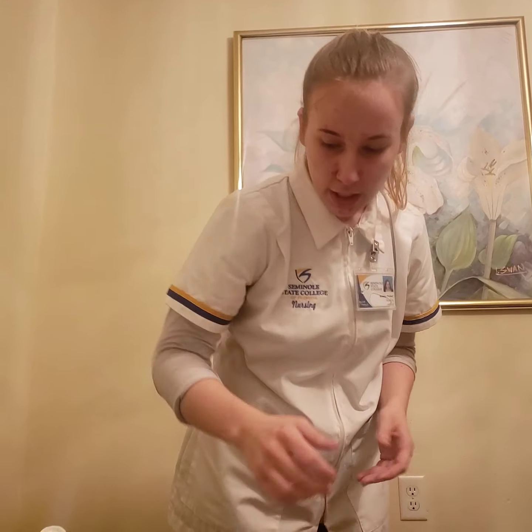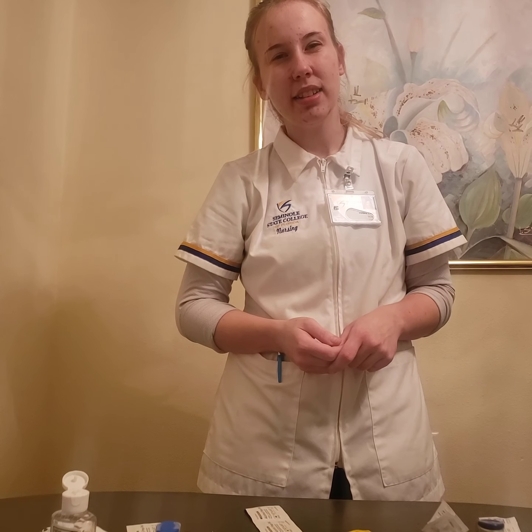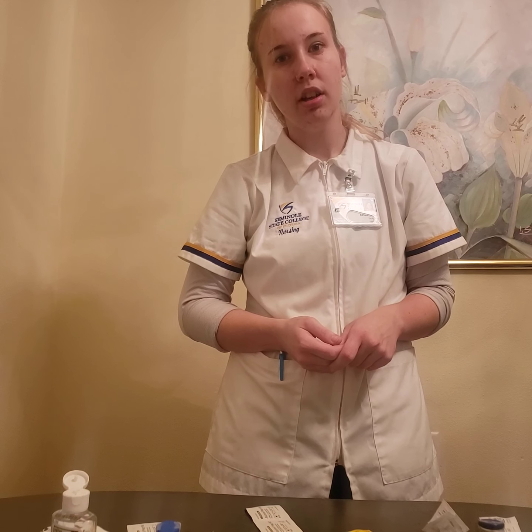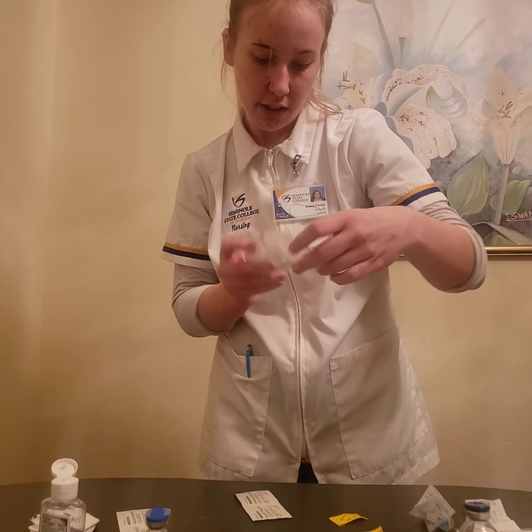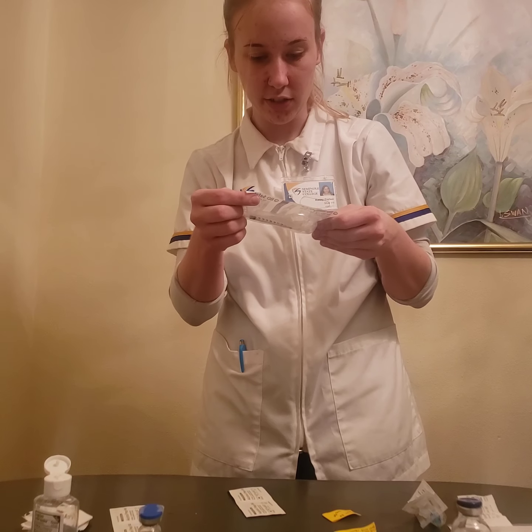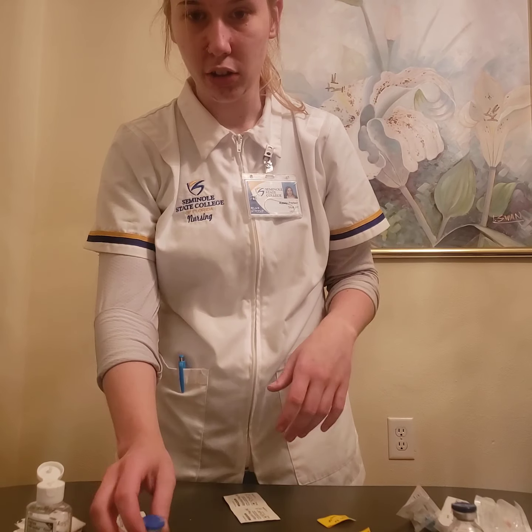Okay. And I'm going to be checking that I have a syringe for my subcutaneous injection. That is going to need to be a 25 gauge needle, and it's going to be 5/8 of an inch long. And I do have that here. I'm going to check, make sure it's not soiled, it's not expired. I'm going to make sure all of my supplies are in good quality.